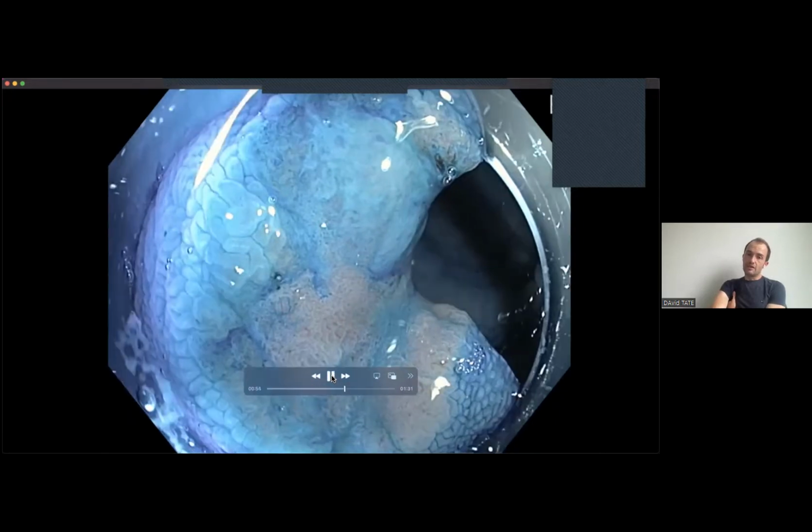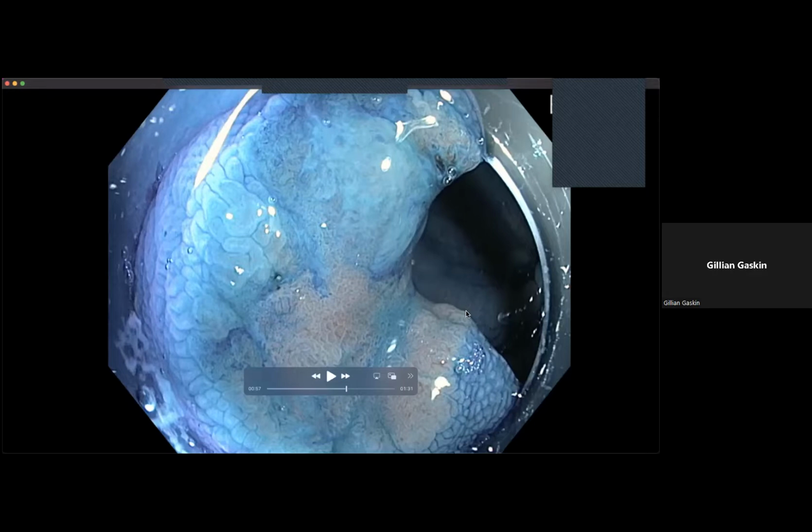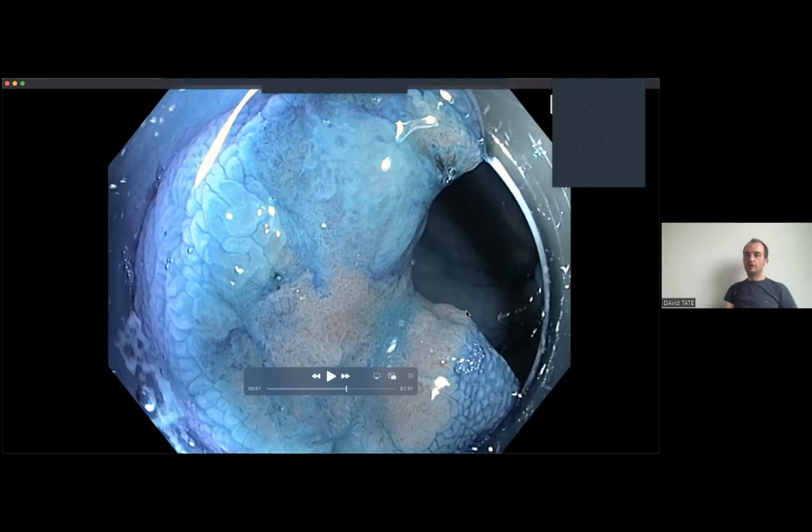So the question is this, and you can beautifully see the demarcated area here: is this demarcated area regular, or irregularly regular, or completely irregular? Is there maintained structure at all? Doesn't look to be maintained at all. Okay, and where exactly would you think? Completely different. Yeah, that's true.